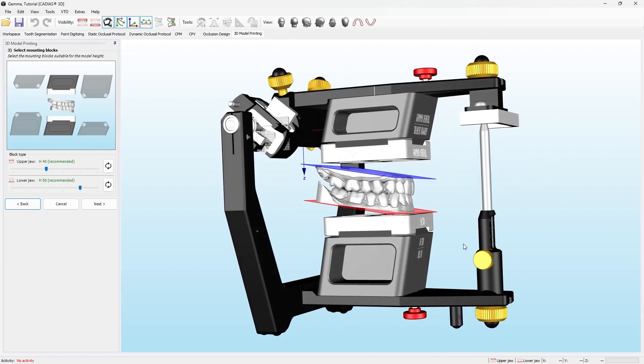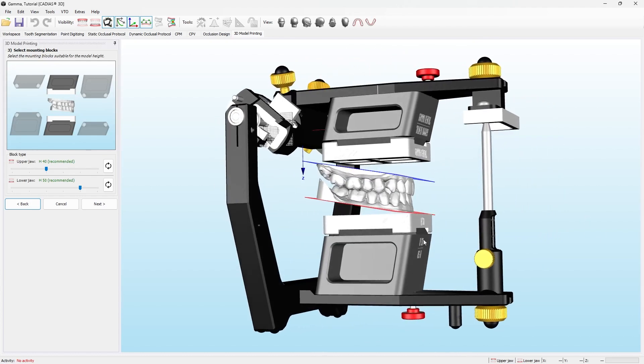On the next step, you can choose the blocks you will use to insert the printed models. However, the recommended blocks are pre-selected.